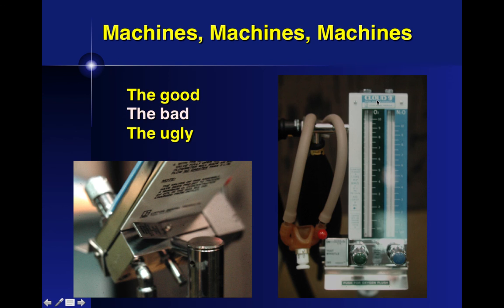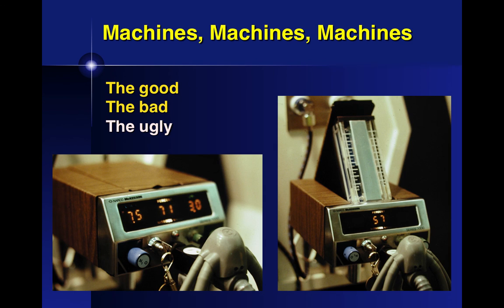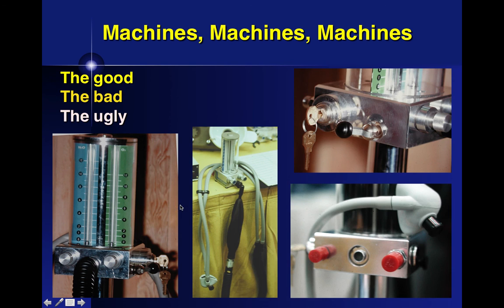I did like the name Cloud 9 with nitrous oxide. That's how some people describe it. Here was a machine that I was really impressed with. Look at that digital readout. Tell me what percentage I'm using, everything you could want to know. And then he says, and if that doesn't work, you pop the top and here are your flow tubes. Well, that's nice backup. I assumed there was some analysis going on in here. There really wasn't anything. It was being done electrically and it wasn't particularly accurate.